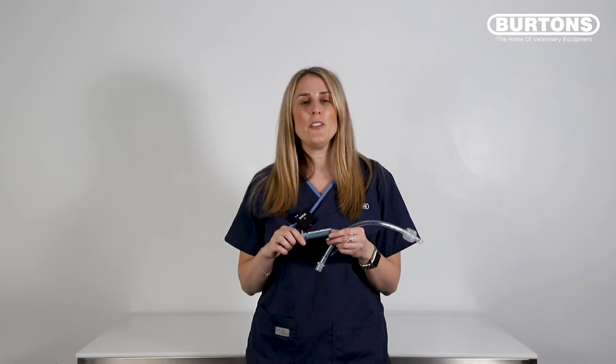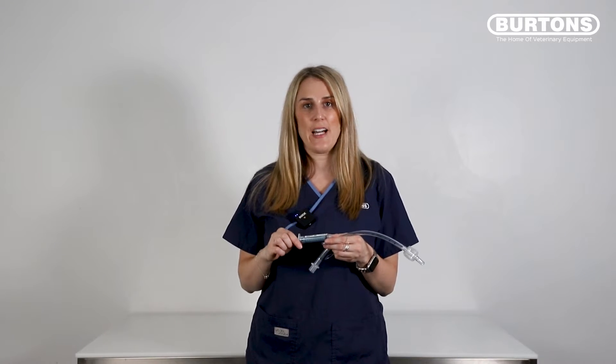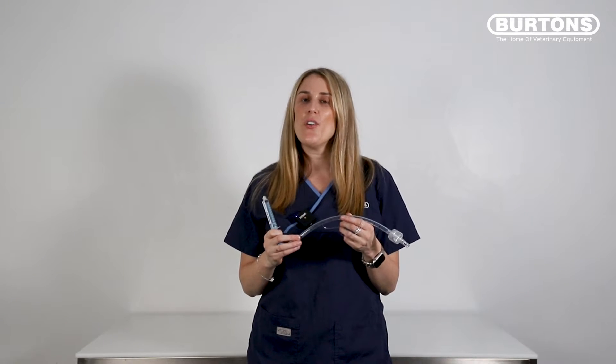You can use the AG Cuff Fill on any airway device that has a cuff. I've got an endotracheal tube here, but you can use it on a tracheostomy tube, on a laryngeal mask airway, and also on a supraglottic airway device.